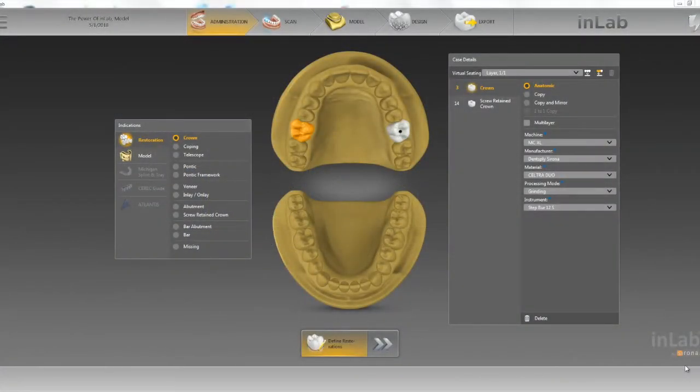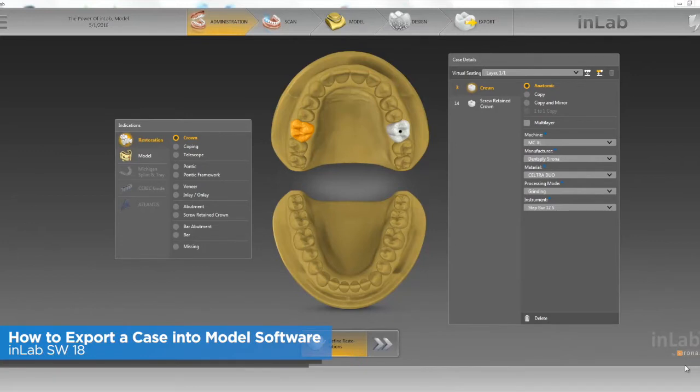Hello everybody, this is Jay Black with Tekken 2. In this video we're going to go over how to export our case to the new in-lab model software.